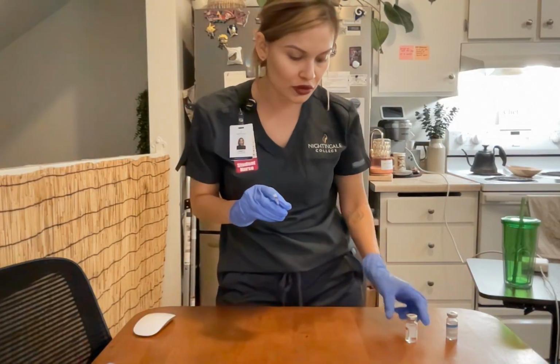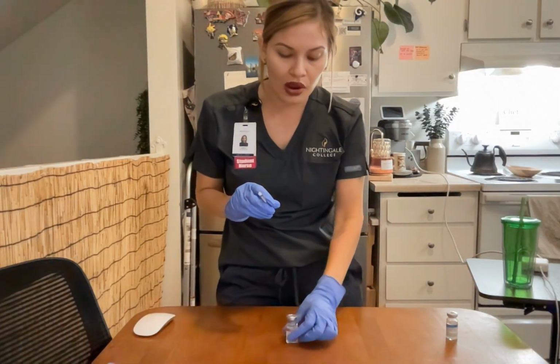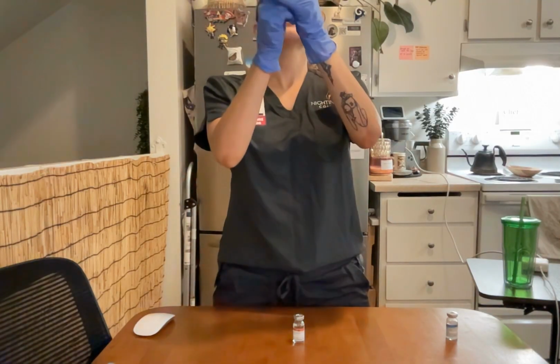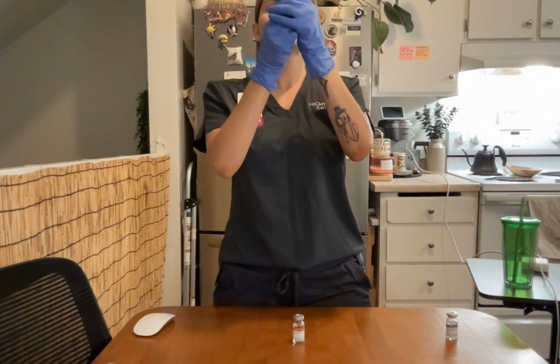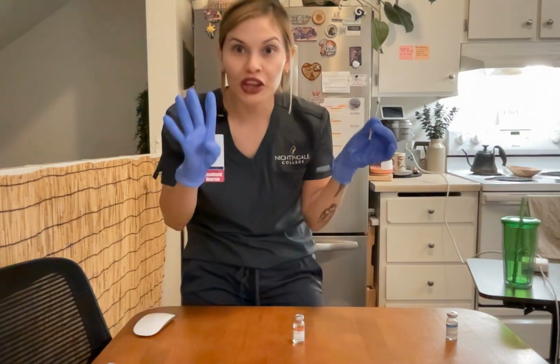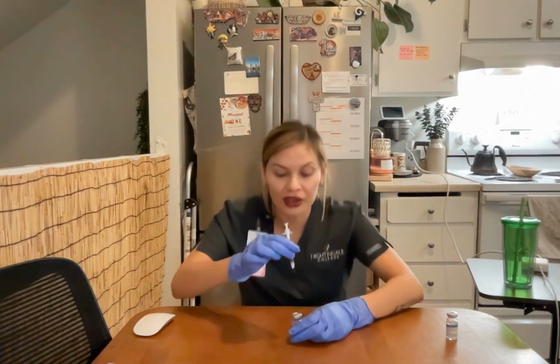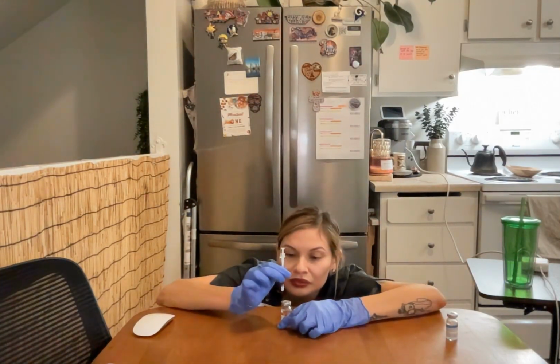Now, I have here the regular insulin vial, and I'm going to fill the syringe with air to the prescribed order of regular insulin, which is 4 units of regular insulin. I'm going to inject the air into the regular insulin vial.